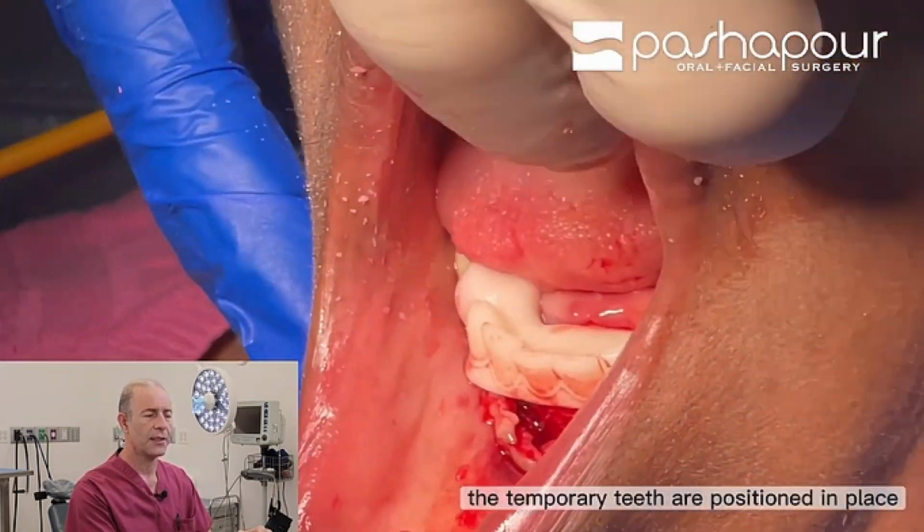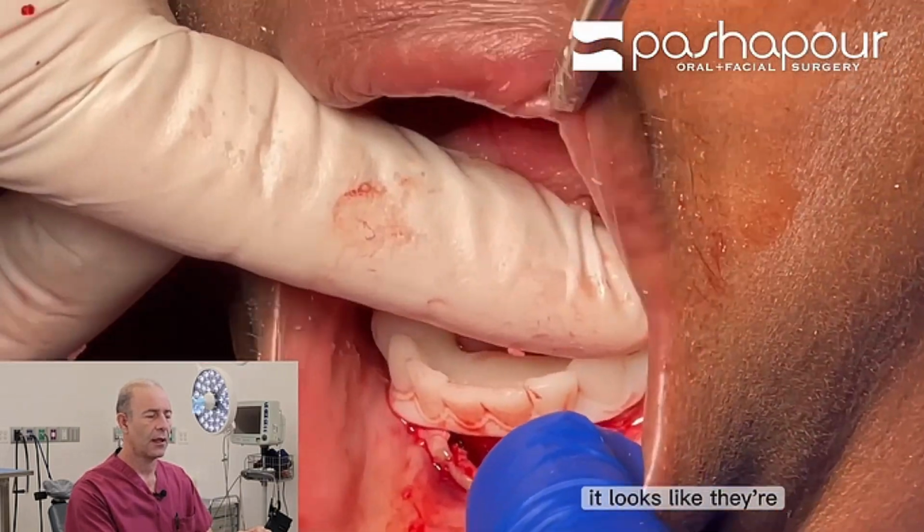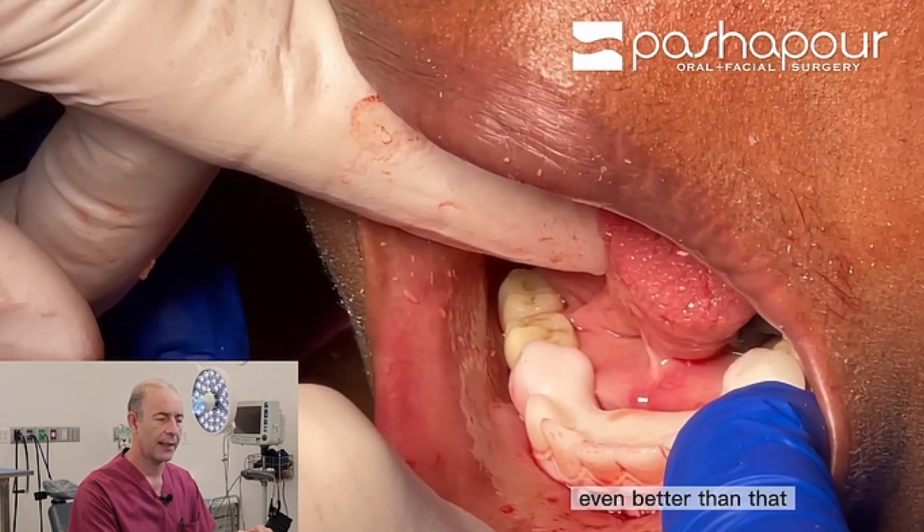At this point, the temporary teeth are positioned in place. It looks like they're fitting. However, we're going to adjust this to make sure it's fitted even better than that.